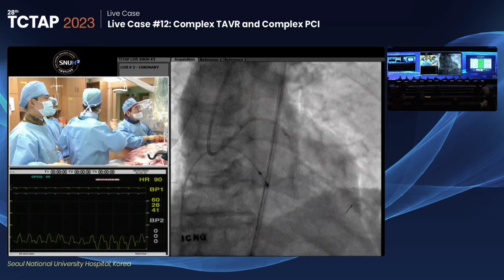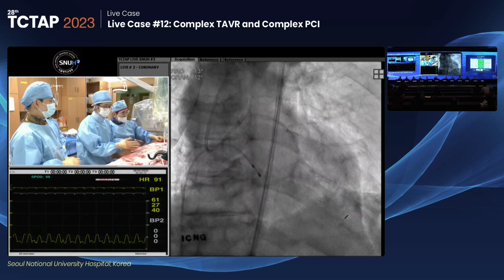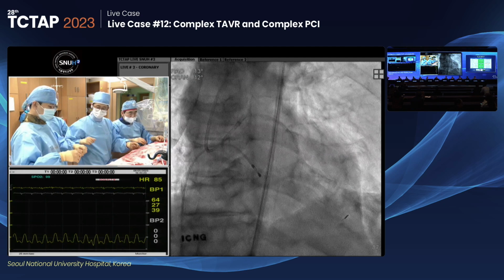Okay. No. Okay. Blood pressure is low. Blood pressure is okay. Blood pressure is a ventricular blood pressure. Okay. As long as the wire moves, it's okay. And sometimes talk to the patient, make sure that he talks.